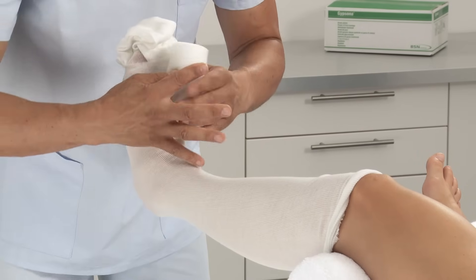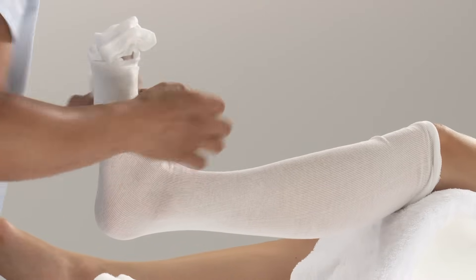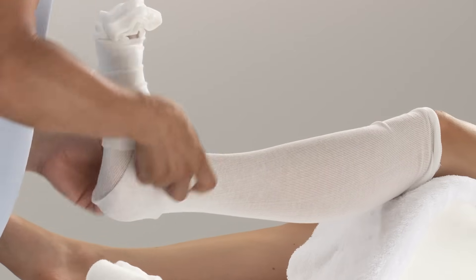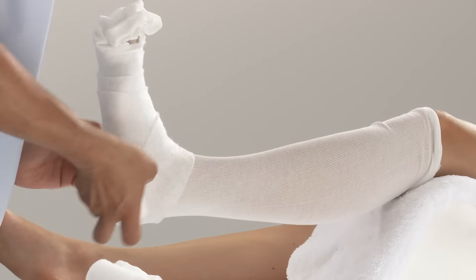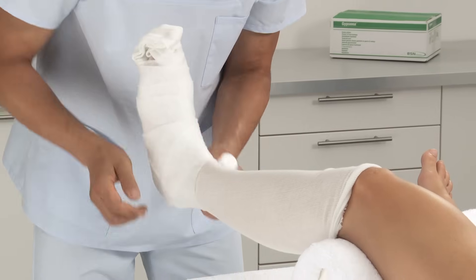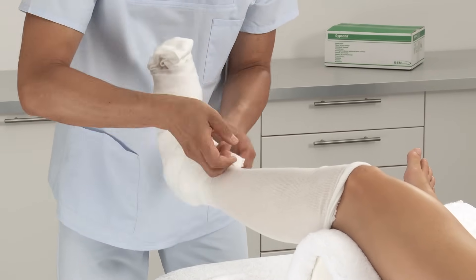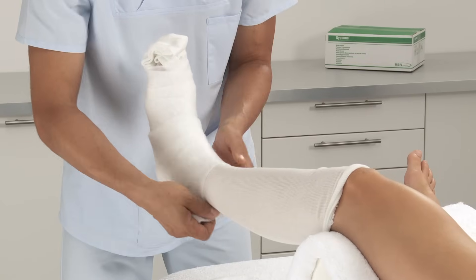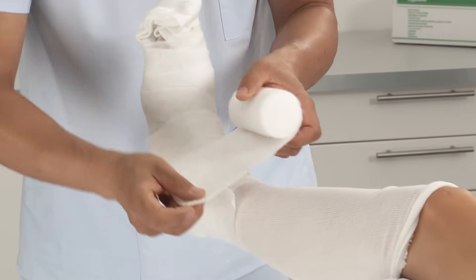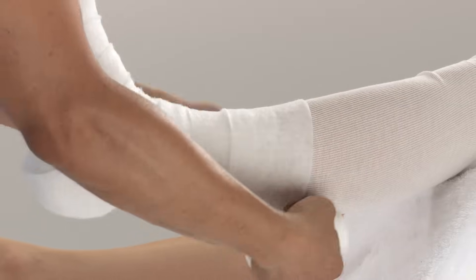Tuck in the extra length of stockinette at the toes. Apply padding to the limb by wrapping it from the metatarsals, around the ankle and up the lower leg. Use a second roll of padding if needed. Use extra padding for any bony prominences.